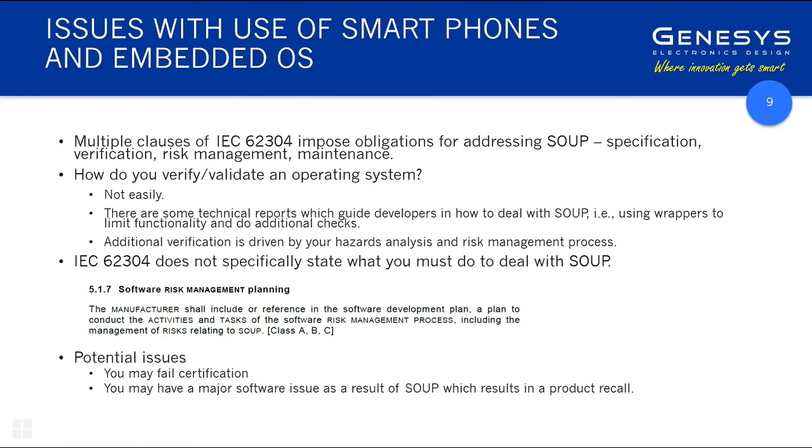And that aspect of the design, the specific use of that LCD display, can be moved to a Class A, but the actual firmware running on the device can be deemed Class B. So you can separate out the critical and non-critical parts.